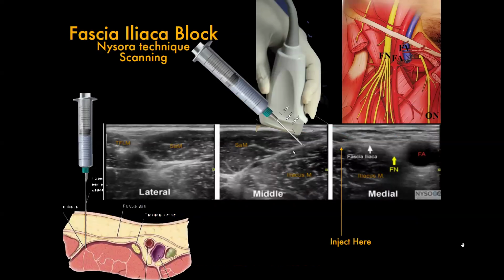So this is the probe medially. You have the femoral artery, right? So your iliac is the femoral artery, and the femoral artery becomes the superficial and deep femoral. The deep femoral artery goes to the bone and muscle. The superficial femoral artery, we all know from the adductor canal block, it runs down the medial thigh, through the femoral triangle, goes under the sartorius, goes through Hunter's canal, and becomes behind the knee as the popliteal. If we follow the femoral artery to where it's the common femoral, that's where you do this block.